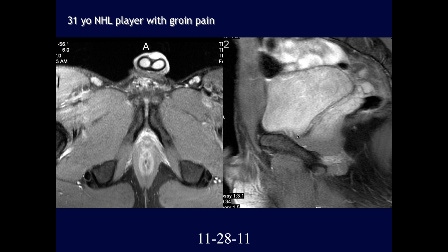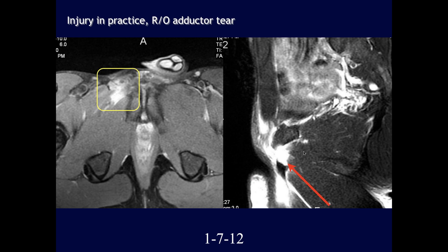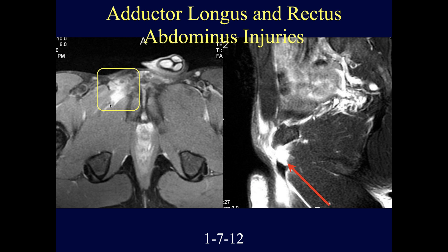Initial imaging on November 28, 2011 showed subtle findings. Two months later on January 7, 2012 with increasing pain, there is now disruption of the right adductor longus with fluid signal and probable hemorrhage compatible with complete tear at the insertion. When these injuries are played through, they can become considerably worse.